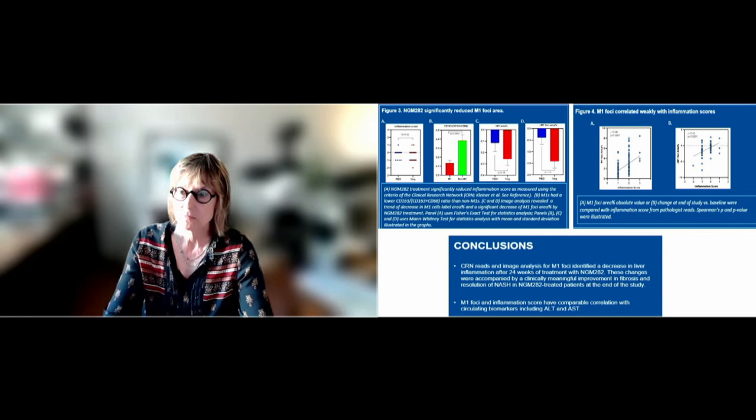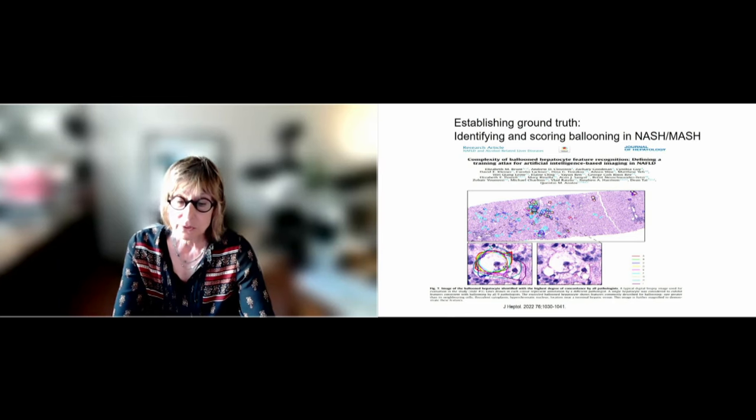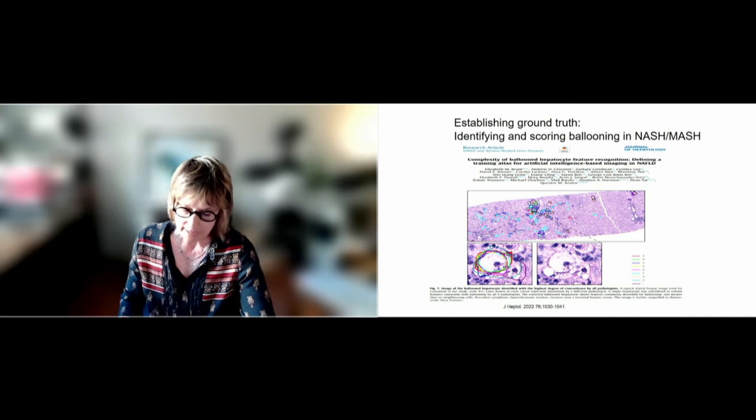With regard to ballooning, as we have all witnessed, establishing ground truth for ballooning has been challenging. Perhaps we now have an opportunity to use computer-assisted image analysis together with simple immunohistochemistry tools that have their foundations in translational science.